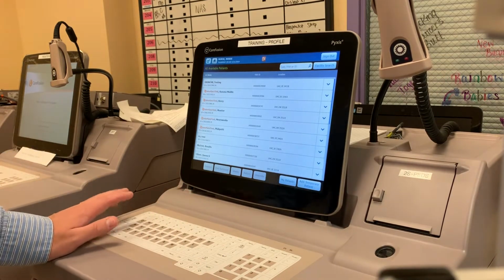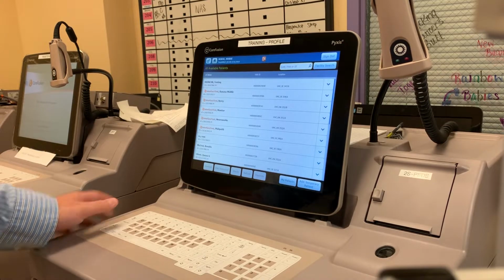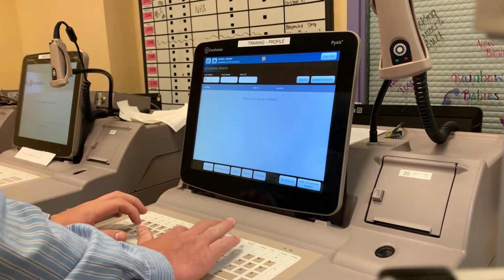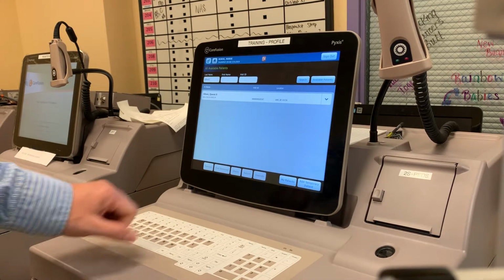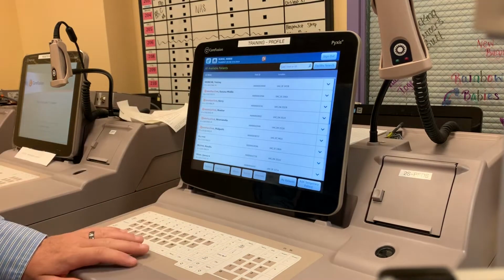If they're not necessarily in your department, but you need to find them, maybe they're coming up from the ED, but Meditech hasn't moved them yet, facility search is at the top, and you can just search someone's name information and find them. Okay? So that's all available patients.